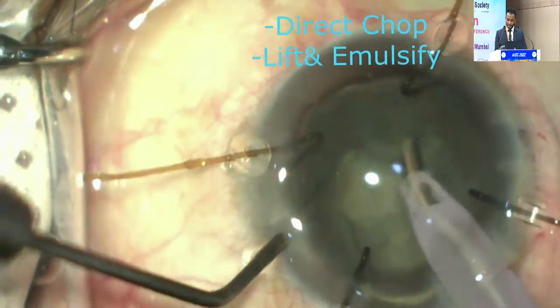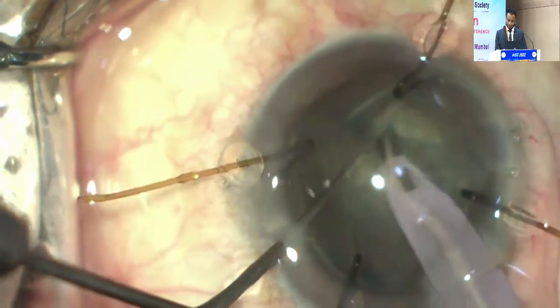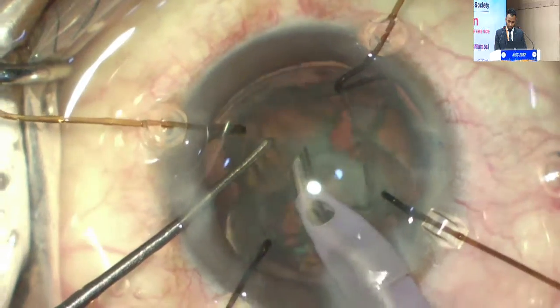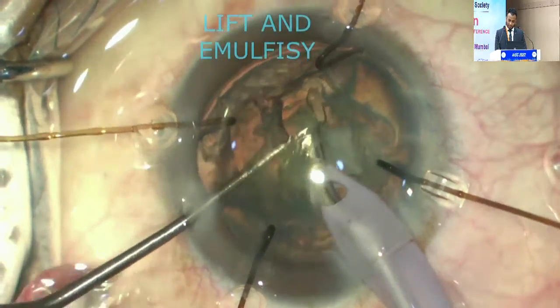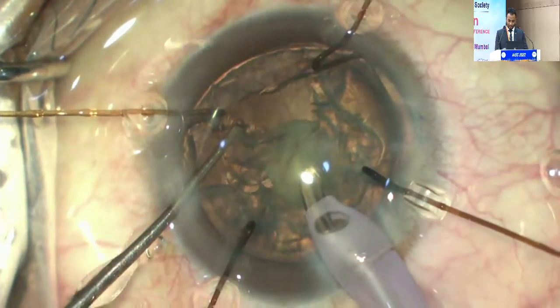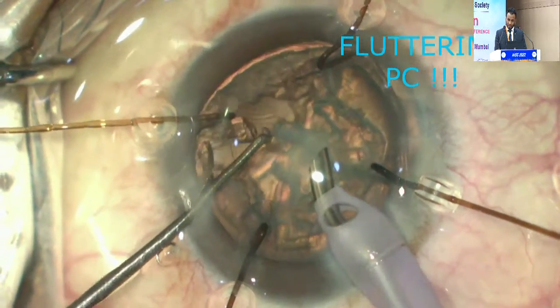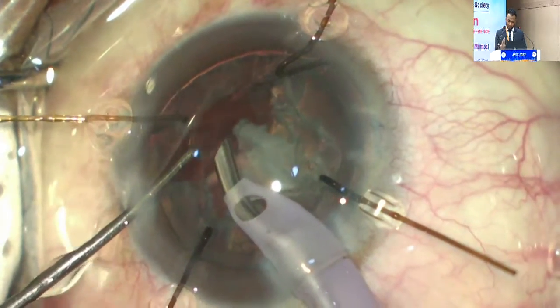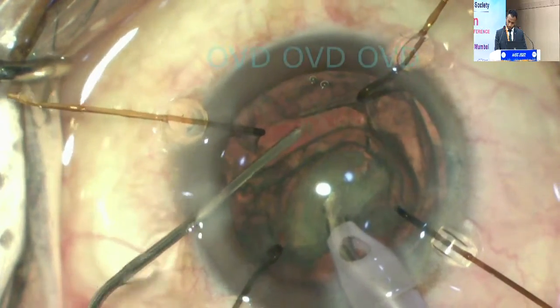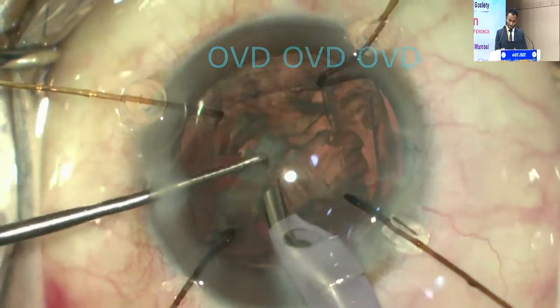Important is to lift it slightly in the capsular plane or the iris plane and remove the pieces because it will prevent the bag stress. You lift it with your second instrument and get it in the central safe zone and emulsify it. If you can see in the quadrant, you may see some fluttering of the PC, and you have to be very careful about it. Otherwise, the whole bag may just come out. Replenish with OVDs so that the PC is pushed back.